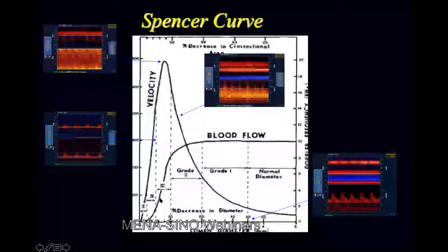That's where the blood flow starts dropping and patients become symptomatic. So if you use transcranial Doppler to diagnose and monitor intracranial atherosclerotic disease, you don't rely only on a high velocity. Blunted flow, a dropped velocity, is indicative of decompensation and a late stage of severe intracranial atherosclerotic disease, close to near occlusion or occlusion. It's very important to understand this figure, as it explains the transcranial Doppler findings in intracranial arterial narrowing.